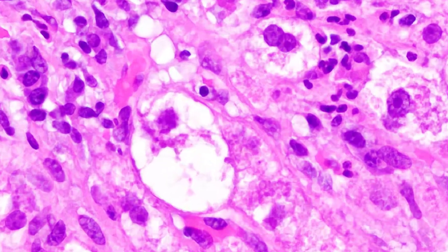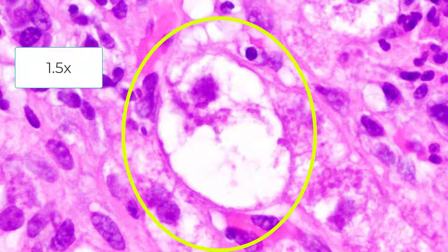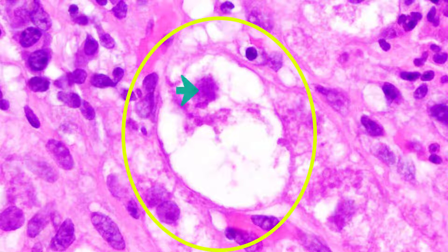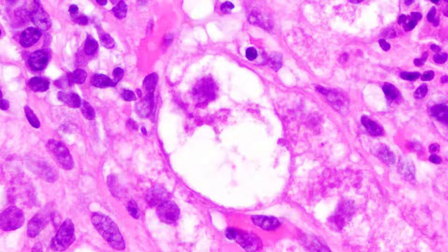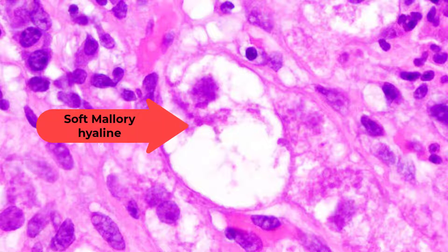Here's a classic balloon cell. It's enlarged — more than 1.5 times the size of an adjacent normal hepatocyte; here it's more than three times the size. Typically, the nucleus is centrally located. And importantly, there's condensation of the cytoplasm, leaving clear areas, with the condensed area typically around the nucleus. At times it looks rather dense and ropey, resembling what is often referred to as soft Mallory hyaline.